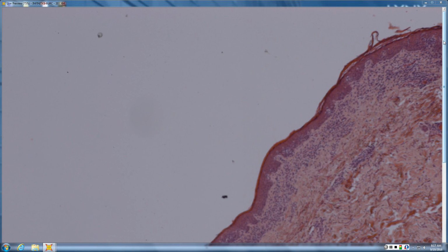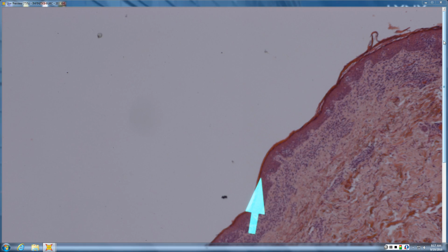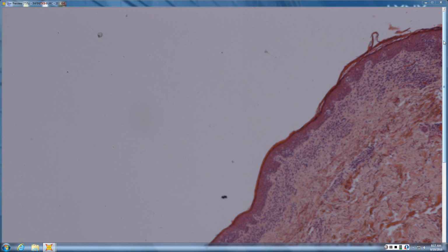It's compact. I don't see any reds, extravasated reds, nothing like MF. So corneum compact, whereas in pityriasis lichenoides acuta, it's a scale crust, and in PLC, it's subacute horn usually. And people get confused with that, even though chronica is in the name. The whole course of the condition is chronic, but every lesion is transient and evanescent.